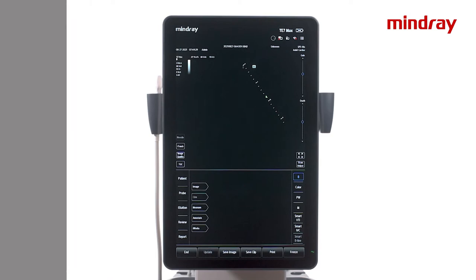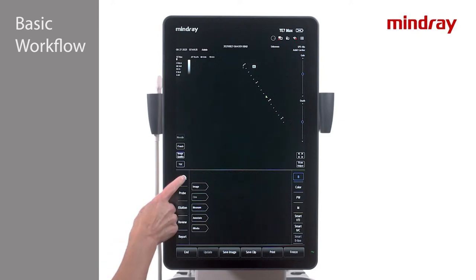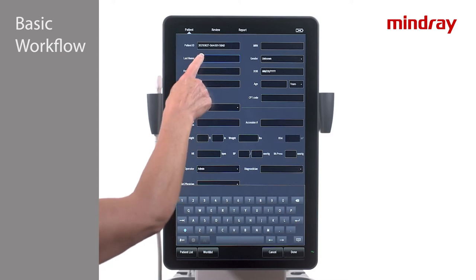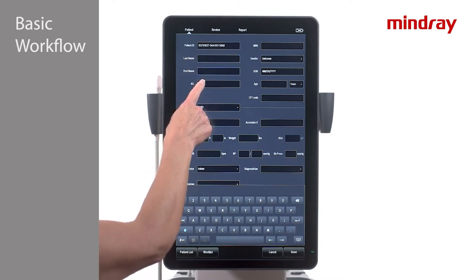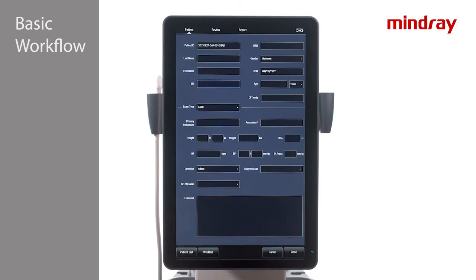The basic workflow of the TE7 is illustrated by the tabs along the lower left side of the screen. Press the patient tab to access the patient information screen and enter demographics if desired. Tapping any of the fields will pull up a keyboard to manually enter data. The system will assign a generic patient ID that includes a date stamp if no data is entered.